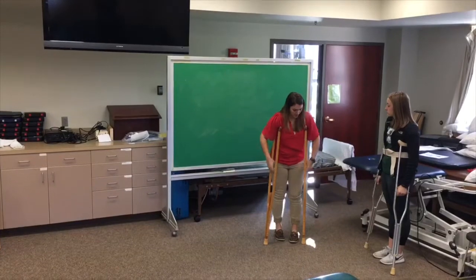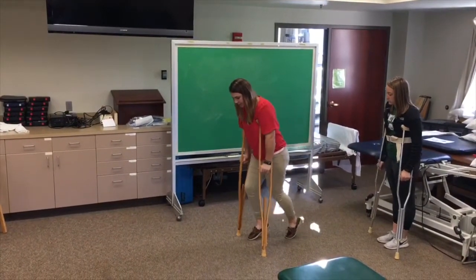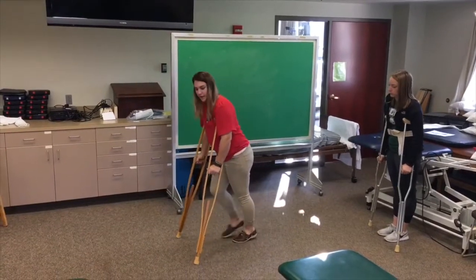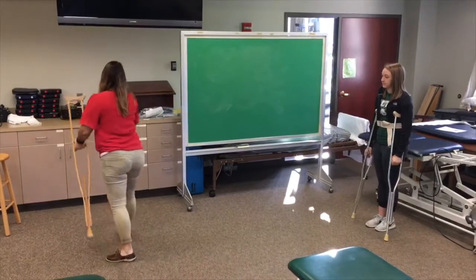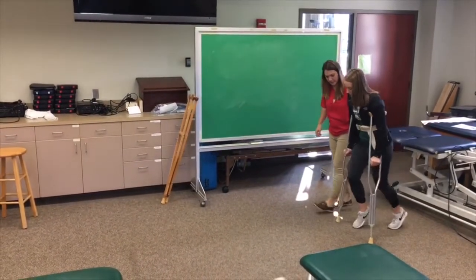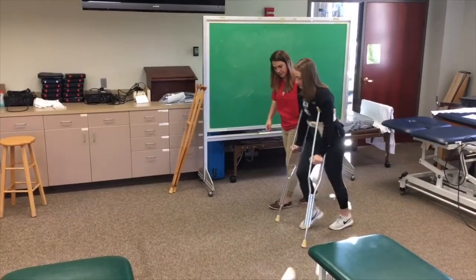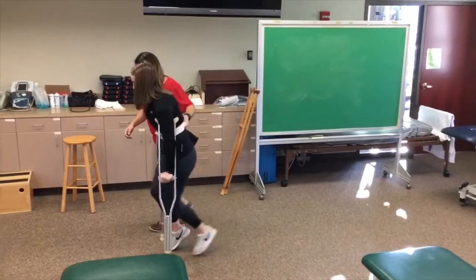When instructing a patient on a new assistive device or gait pattern, demonstrate the proper use of this technique. Use verbal descriptions that should reinforce your demonstration. Be sure to use simple, patient-friendly language. A patient may be unstable during initial gait training. Ensure safety by using a gait belt and properly guarding through the initial gait training sessions.